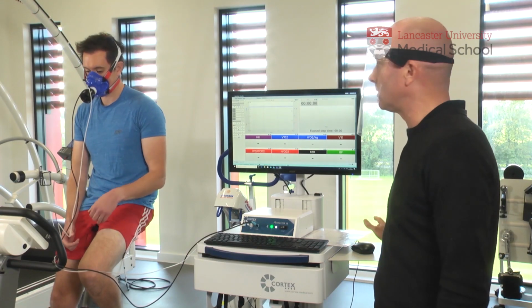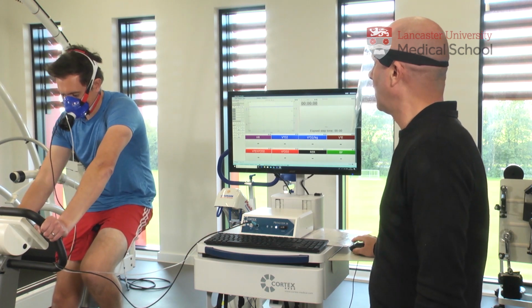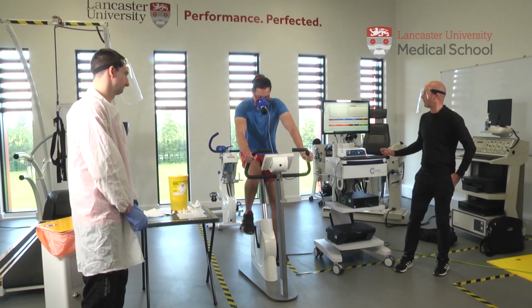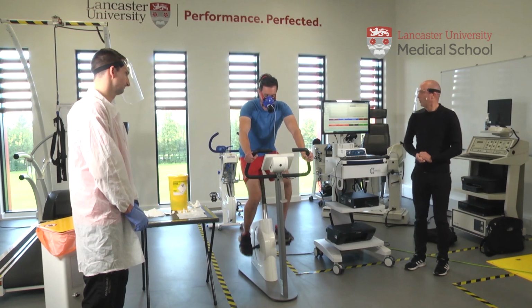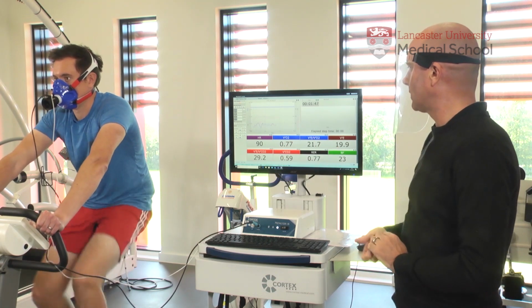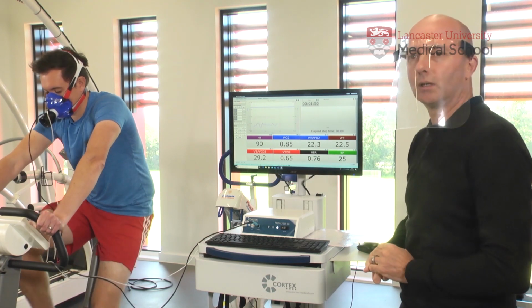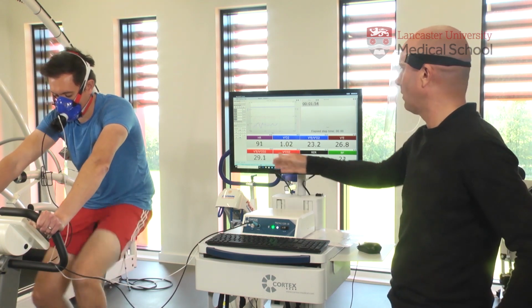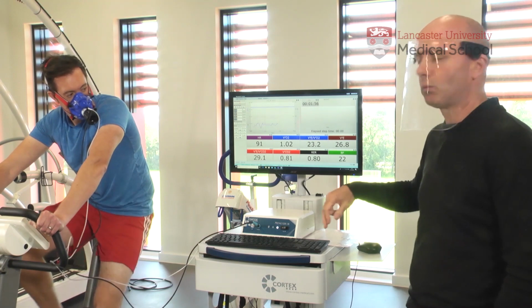So Chris, you're going to start at 25 watts. And ready, off you go. So on the screen now we see that we're collecting various data related to the gases that he's breathing in and breathing out, and his heart rate. So we've got his heart rate there at 91.